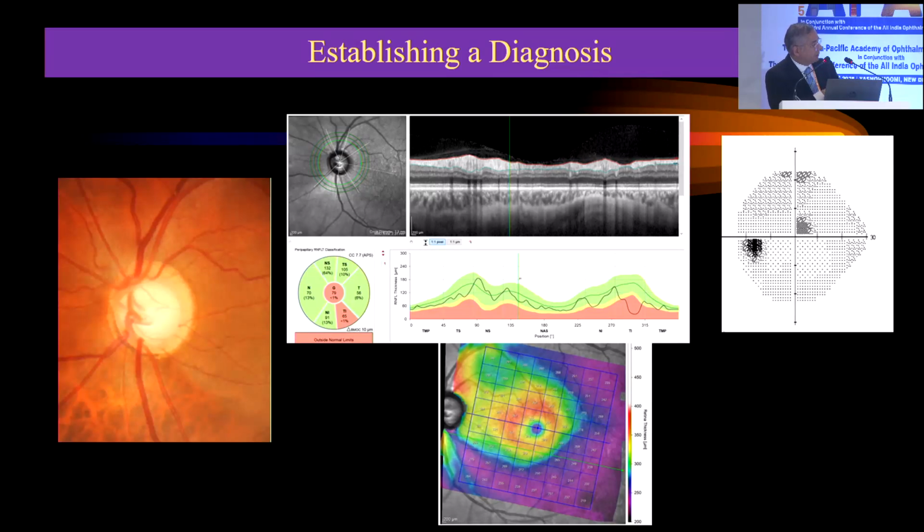It is the loss of the ganglion cells here that actually create the temporal raphe sign that Professor Kehoe Park has shared with us. This loss that causes this loss of the nerve fiber layer and ganglion cells is causing a small field defect up in this region. You can also see it on a color picture of the optic nerve.